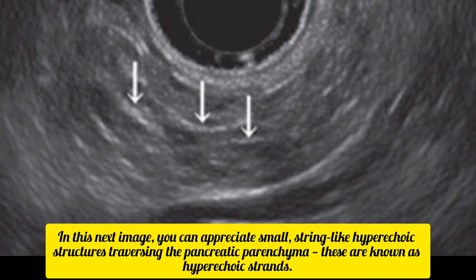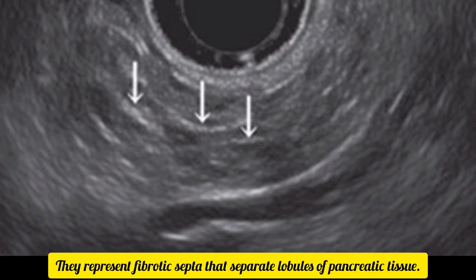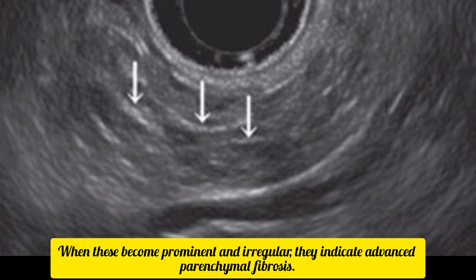In this next image, you can appreciate small, string-like hyperechoic structures traversing the pancreatic parenchyma. These are known as hyperechoic strands. They represent fibrotic septa that separate lobules of pancreatic tissue. When these become prominent and irregular, they indicate advanced parenchymal fibrosis.